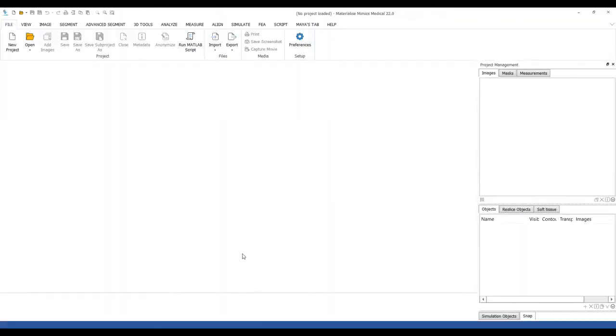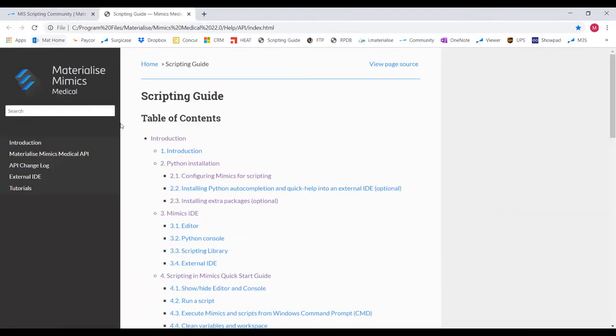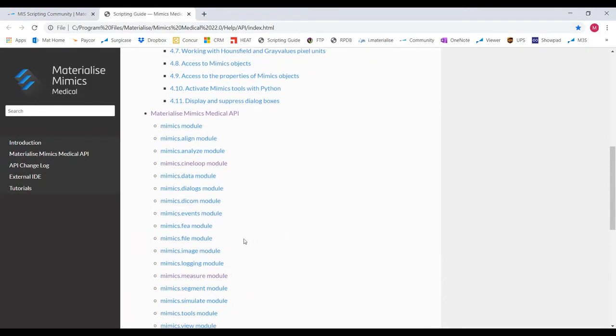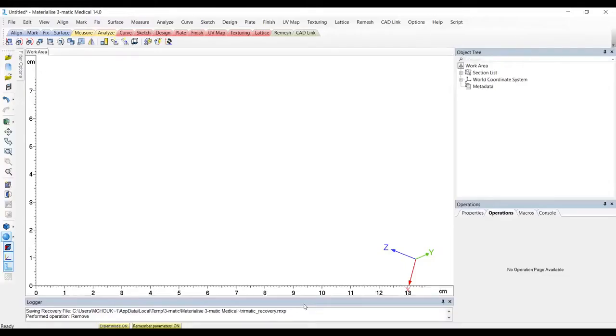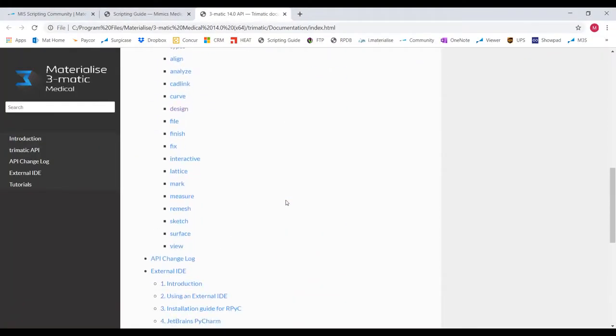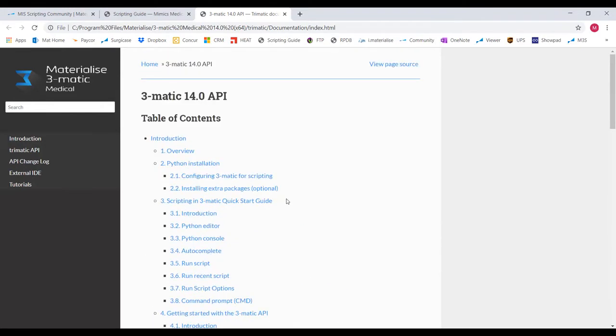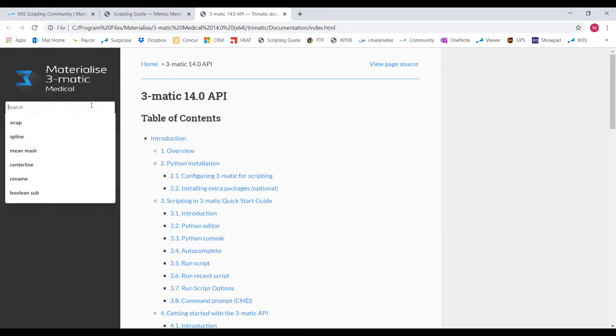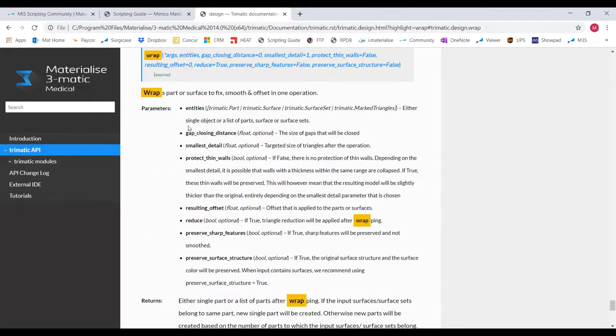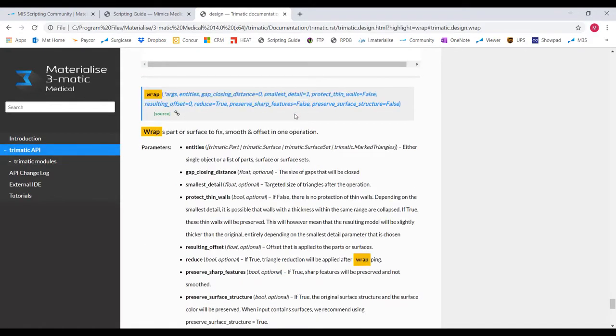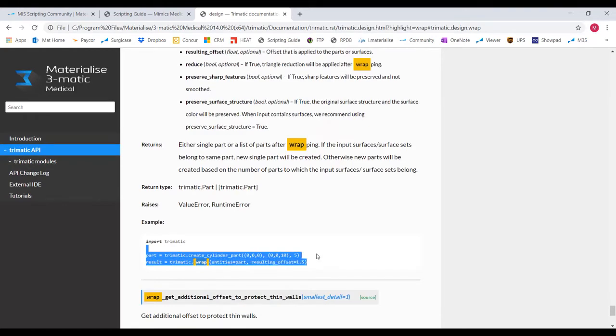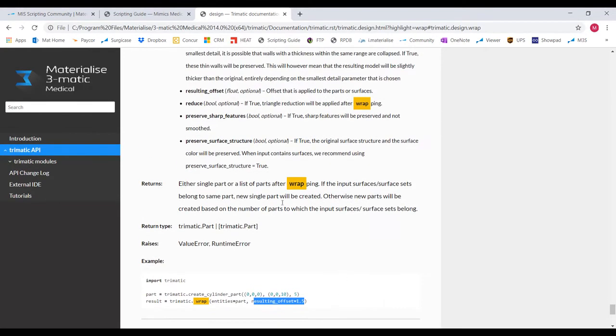Finally, one more helpful tool for scripting in Mimics and 3Matic is our scripting guide. There is one for Mimics and one for 3Matic. For Mimics, this can be found under the help tab and looks like this. For 3Matic, it's also under the help tab and looks like this. Let's say you'd like to wrap your part using scripting. You can search for it in the guide and find out what it should look like as well as an example and what the parameters look like in the scripting format.